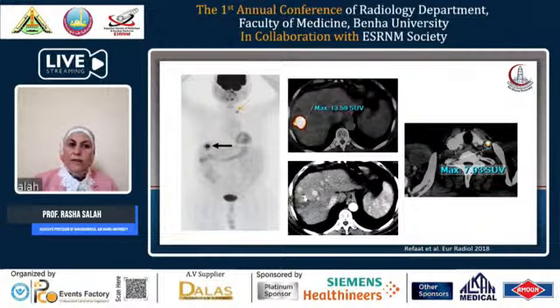PET-CT is also very helpful in assessing post-treatment changes, especially if we are performing the loco-regional treatment as a bridge for hepatic transplant, because we need the proper staging not only for the hepatic parenchyma, because we are going to remove all this hepatic parenchyma, but also for the distant metastatic load in these patients.